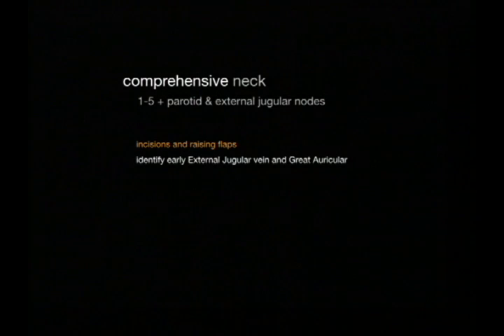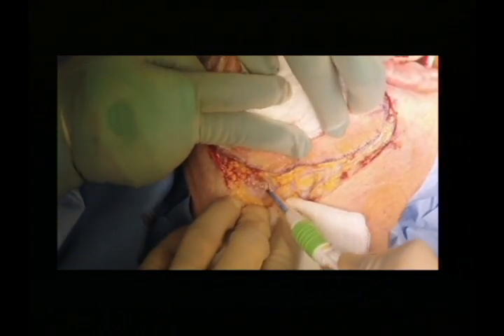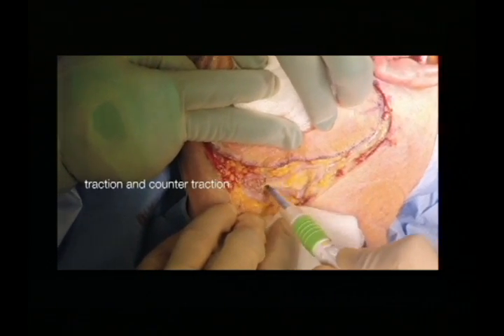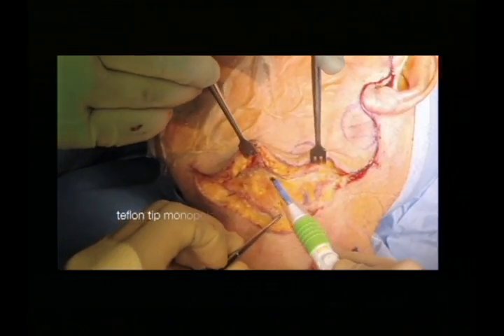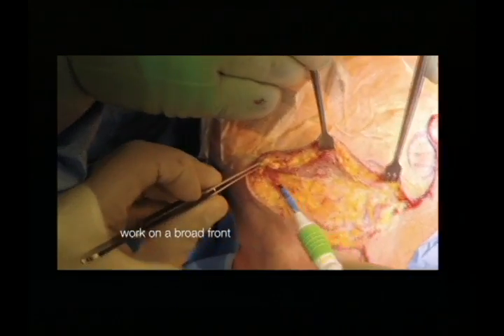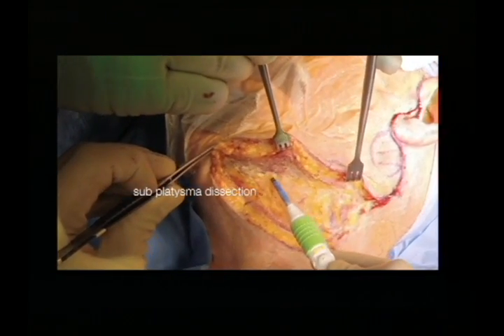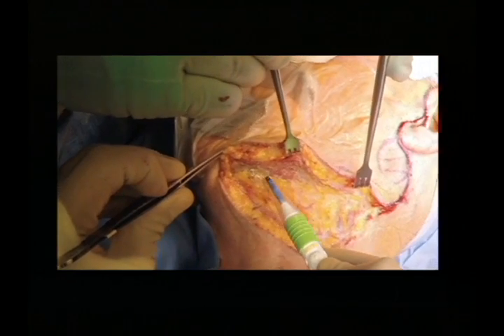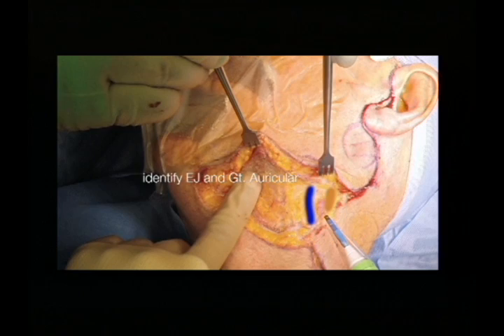In raising the flaps, one of the key things we look for and try to identify early are the external jugular vein and the great auricular nerve. Coming through platysma, we like traction and counter-traction, so initially we don't use retractors — keep everything flat. We like to operate with a monopolar diathermy with a smoke evacuator. We work on a broad front, and at this stage the patient is not paralyzed so we can look for the marginal nerve. We find the mandible early and identify the external jugular vein and great auricular, staying above these.